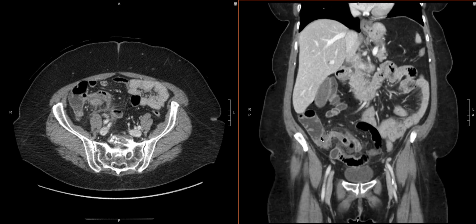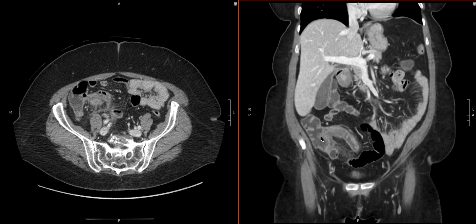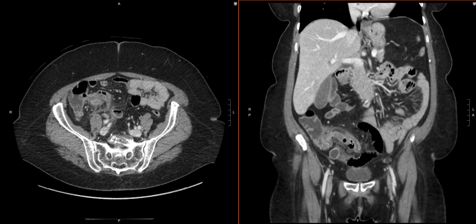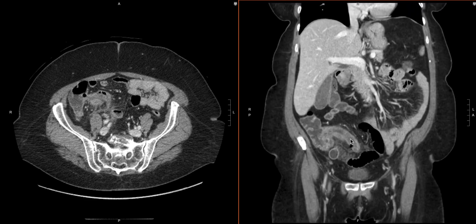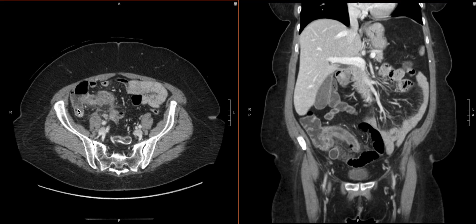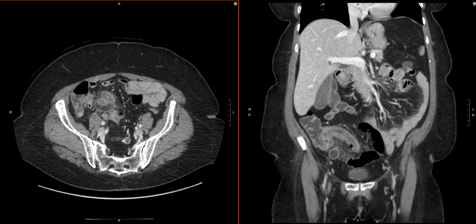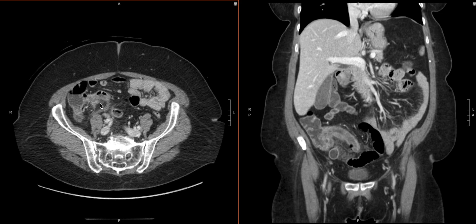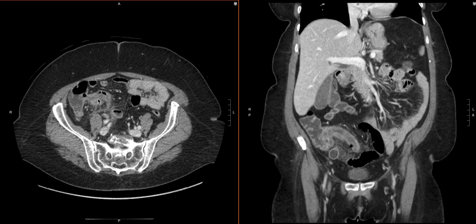This is why it's so important to be very deliberate. This is the terminal ileum. And then when we scroll in the other direction a little bit, we see that the appendix is right below it. Right here is where the appendix comes off, right below the terminal ileum. Really important to orient yourself so you don't confuse the two.